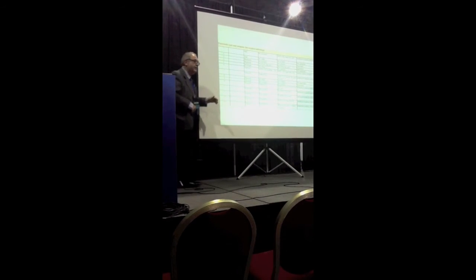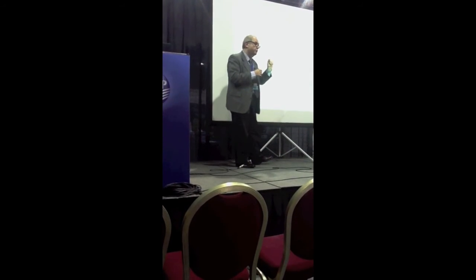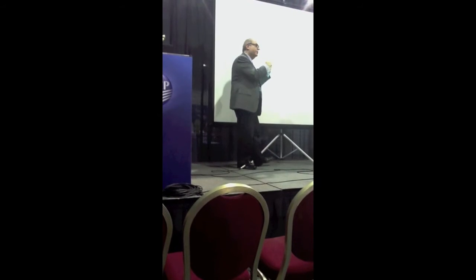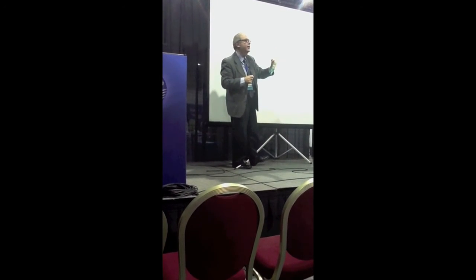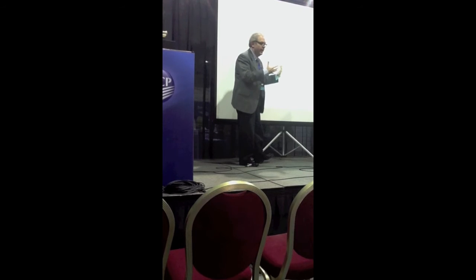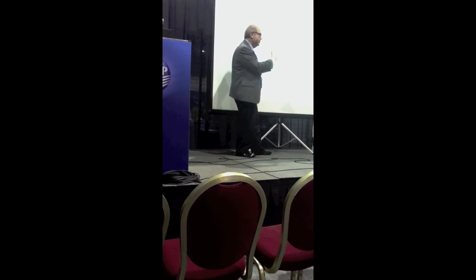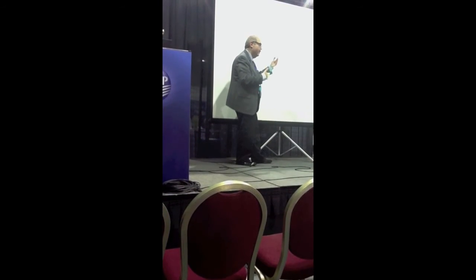We then looked at 14 cyst wall biopsies. Now, many GI docs are doing a procedure for pancreatic cysts where they aspirate the cyst and then they puncture the wall to try to get at the lining of the cells. These are difficult specimens. They can be hypocellular, and oftentimes they won't be able to make a diagnosis of cancer. Well, you can see that, again, there were a number of cases where there weren't enough cells to be able to do a mutational analysis from the cells themselves.